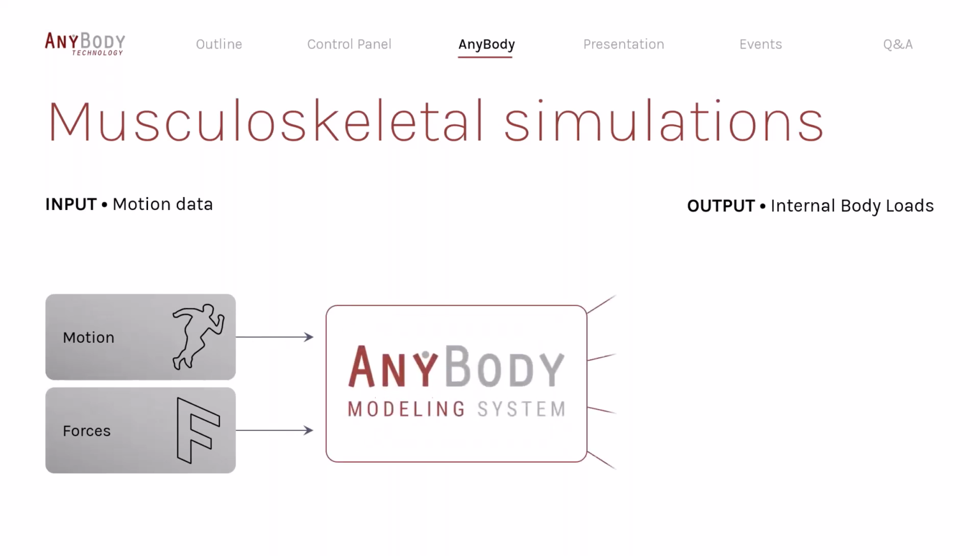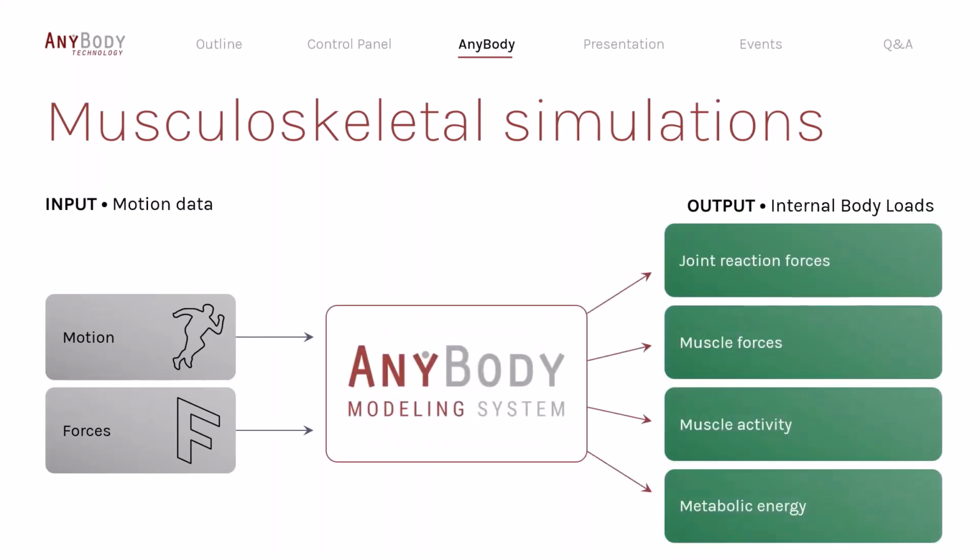So let's begin with having a look at what the AnyBody modeling system actually is. The software allows you to do musculoskeletal modeling and simulations. As input, it takes motion data as kinematics and forces, and it calculates the internal body loads as joint reaction forces, muscle activity, and metabolic energy.